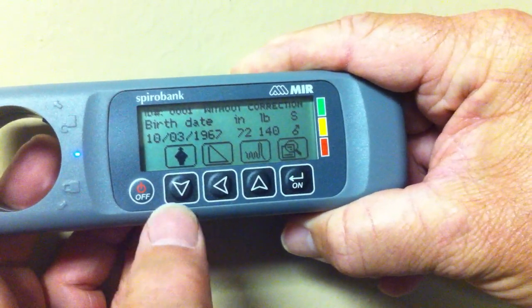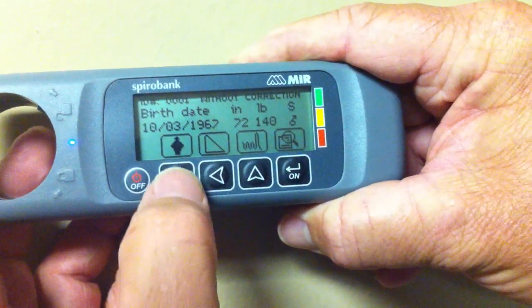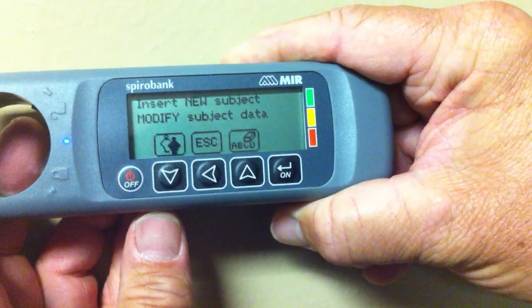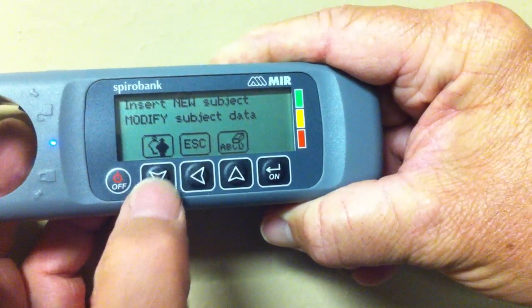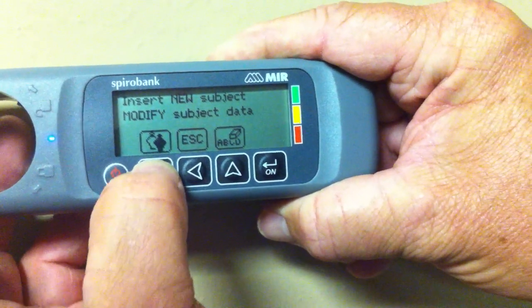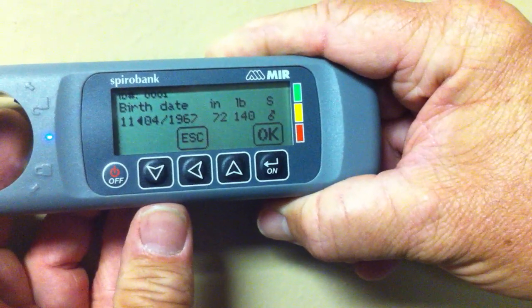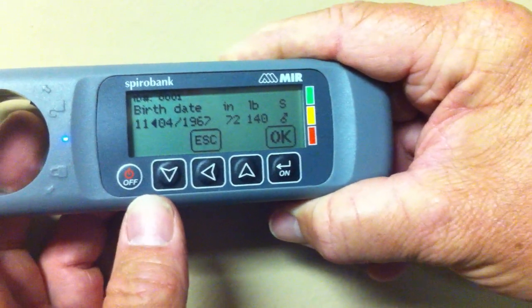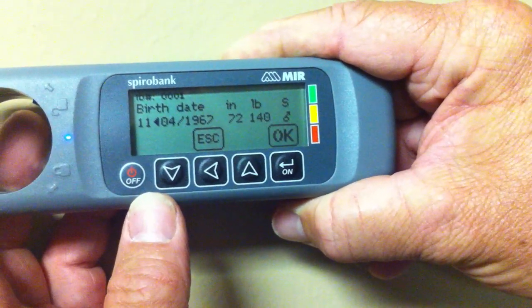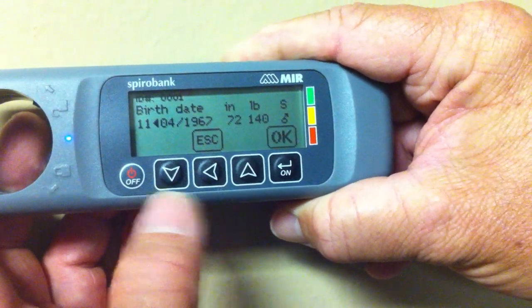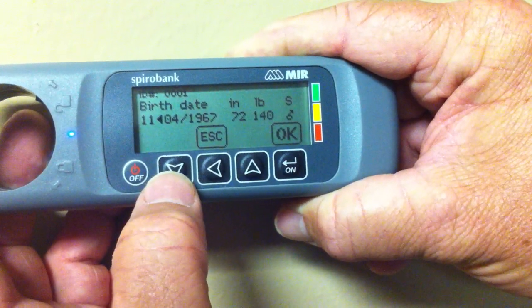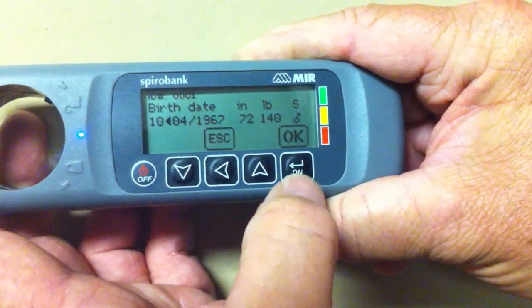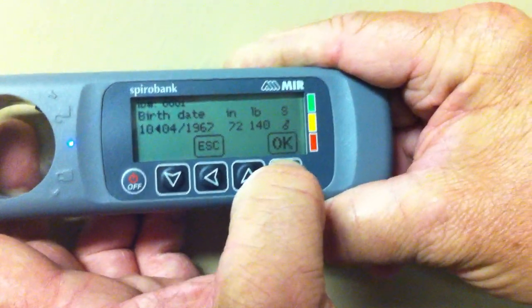Hit the down key one time, then hit the down key another time. You may choose the birth date of the patient — month — using the scroll up and down keys. Hit OK.